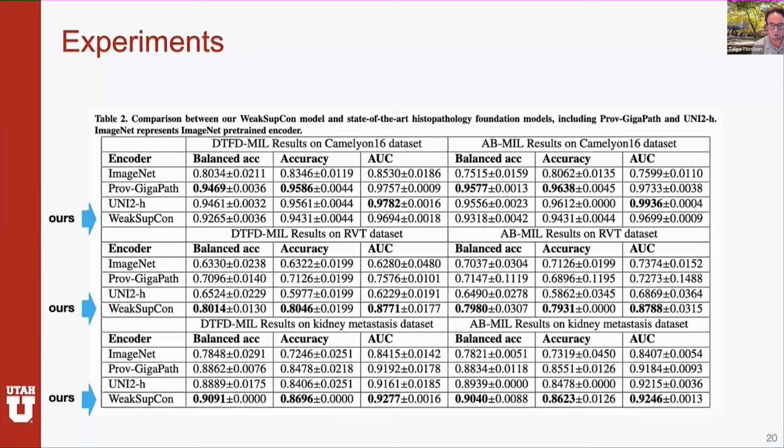But then in the middle, we have the RVT data set, where we were surprised, in fact, to see such a strong difference: by quite a large margin, we were able to outperform the foundation model features. This could be because maybe this data set is somehow out of distribution for the foundation model. It hasn't seen examples that are similar to this, right?